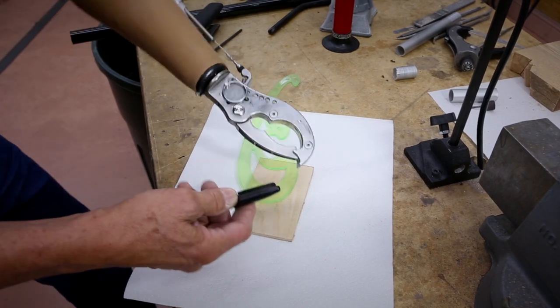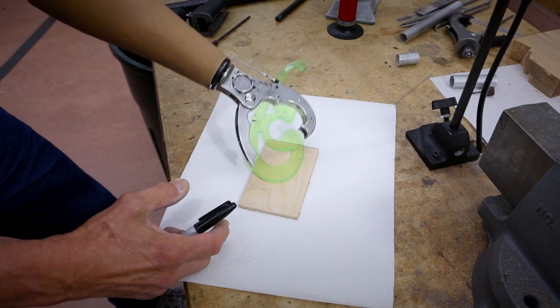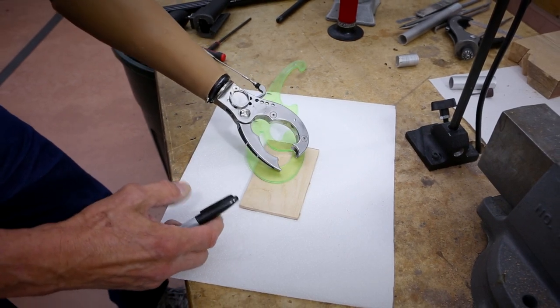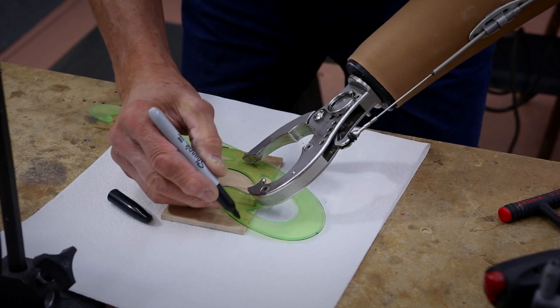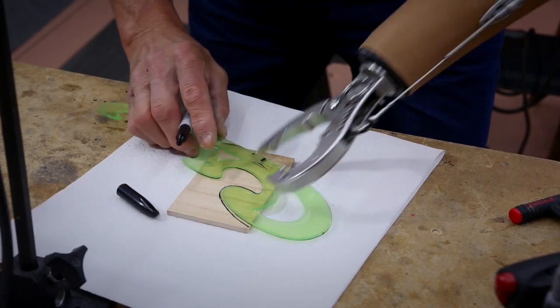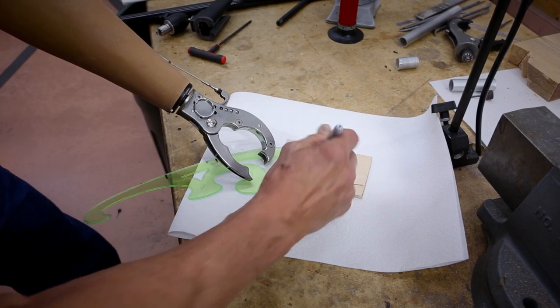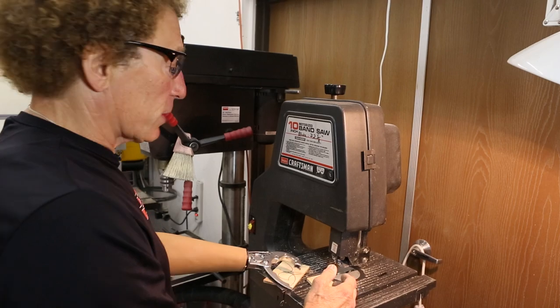One of the things I like to illustrate about a voluntary closing prehensor is that I have the potential for a wide grip or a narrow grip — two-point pressure. So if I want to stabilize a template like this for creating an arc, I have the capability of doing that. I'm in the TRS prototype shop and I've got a bandsaw here.